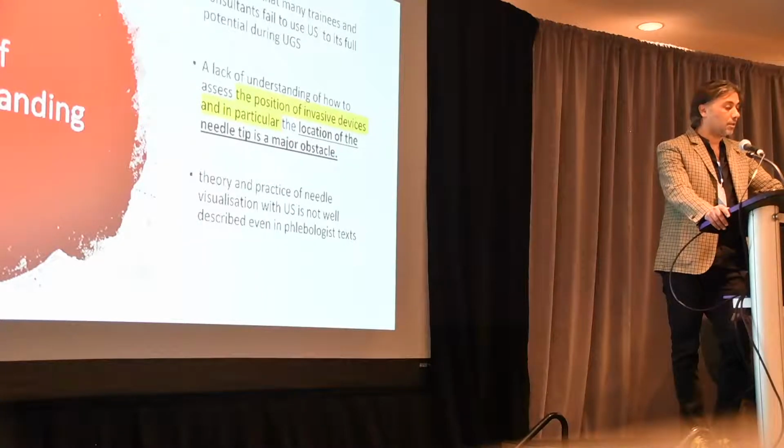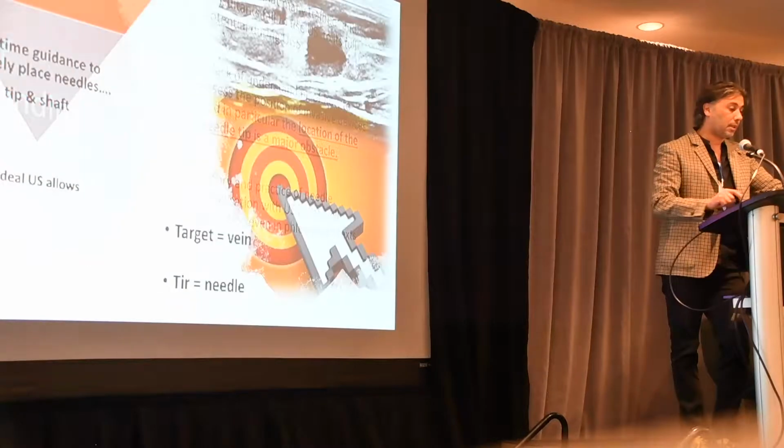The lack of understanding of how to assess the position of the invasive device, in particular the location of the needle tip, as we said yesterday, is a major obstacle. The theory and practice of needle visualization with ultrasound is not well described, even in the phlebology texts.